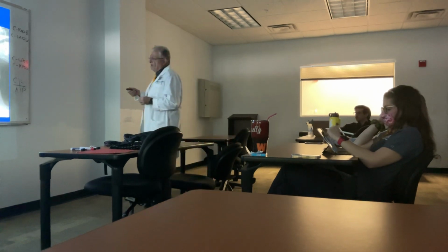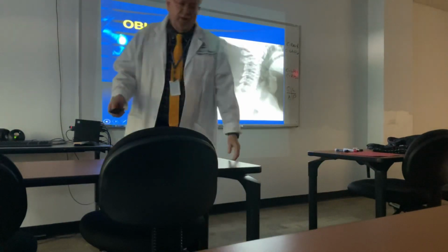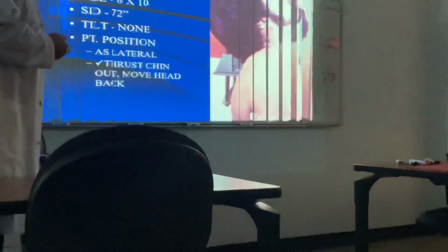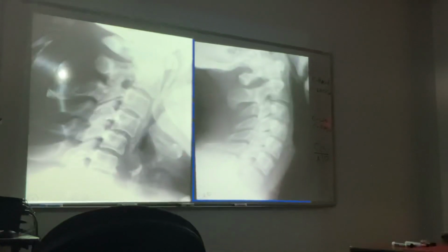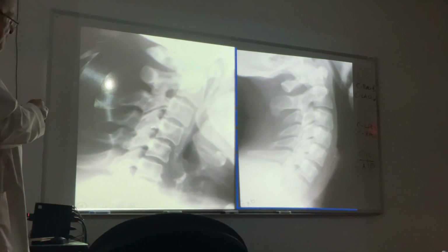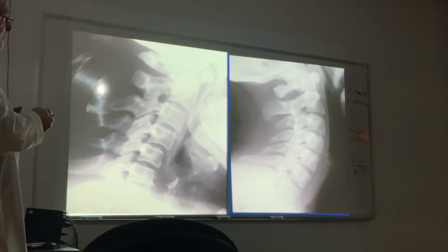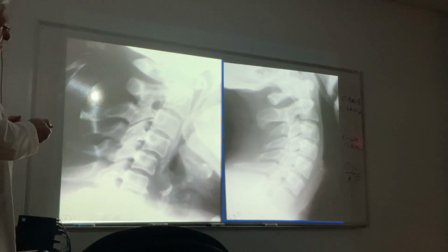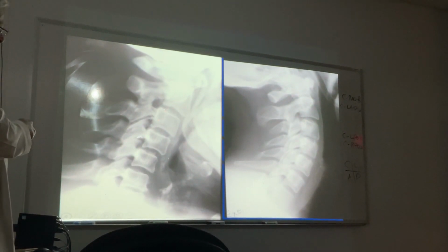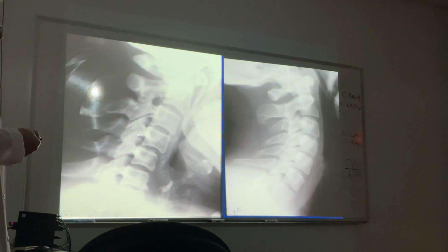All right, so that's what IVFs look like. We're gonna show you how to do that, and we'll have no problems if you understood what we were trying to do with the first 3 views, okay? So this is what it looks like. The space between occiput and C1 reduces when you do flexion. All right, notice the angle of the mandible, you can tell it's tipped down. On extension, the occiput is going inferiorly at this level, so then we make an evaluation of what's happening at each level based on the changes that we see. We'll show you how to do the analysis, all right? So an example of flexion and an example of extension.